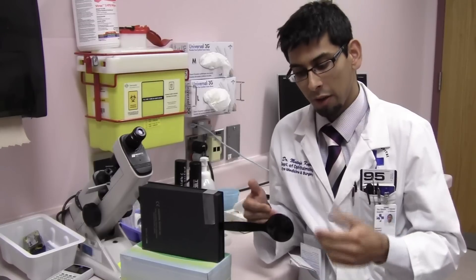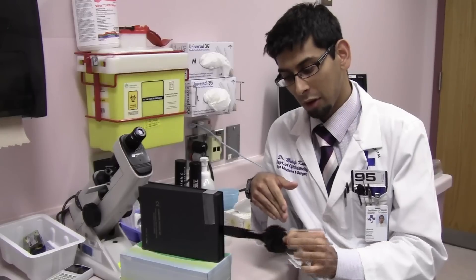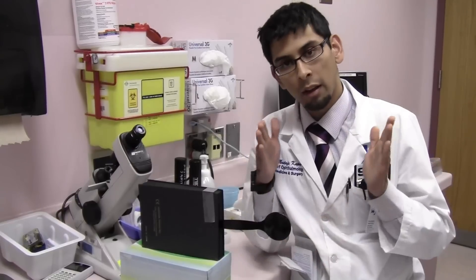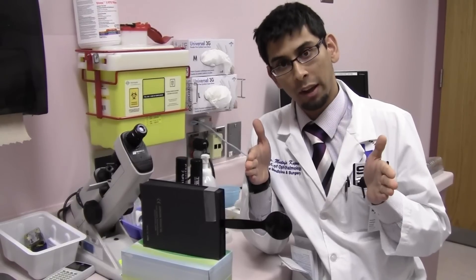I've made this little contraption here. This is going to act as the occluder — occluder down, occluder up. We're going to keep the occluder up for most of the video. These are going to be my eyes: this is my right eye here, and this is the left eye here.